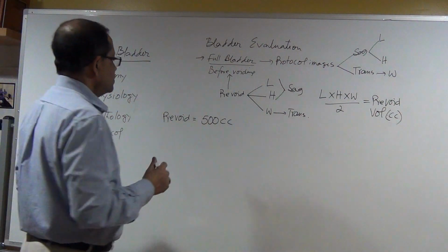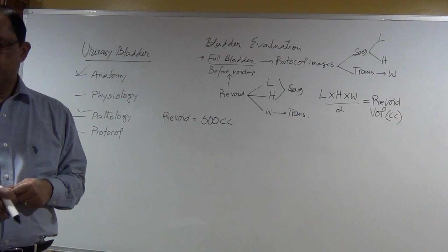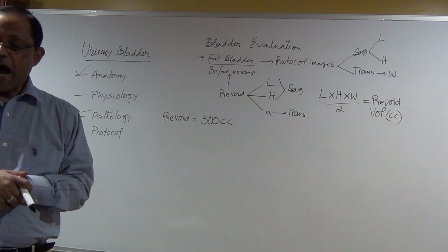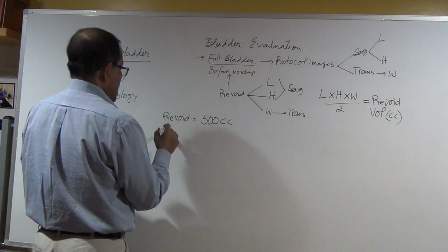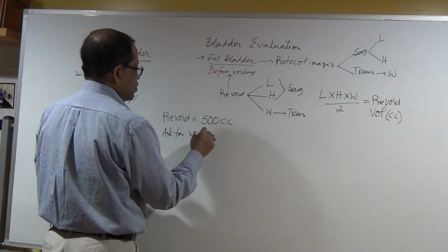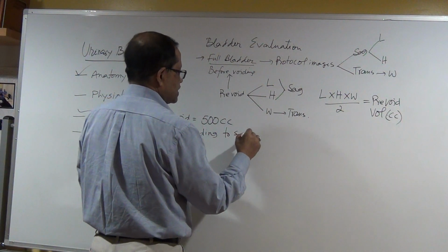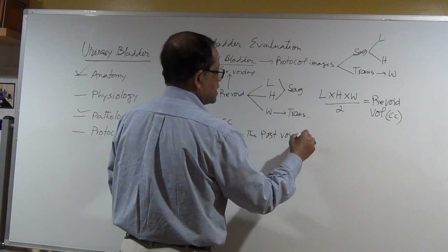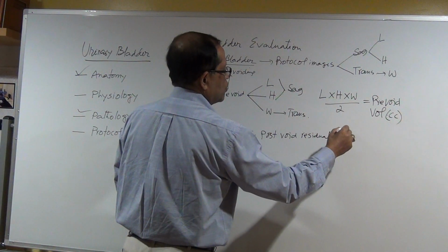Okay? So now I will ask the patient to empty the bladder. Why? I like to see the post-void residual volume. So ask for voiding to see the post void residual volume.